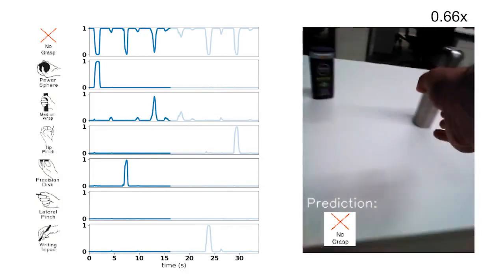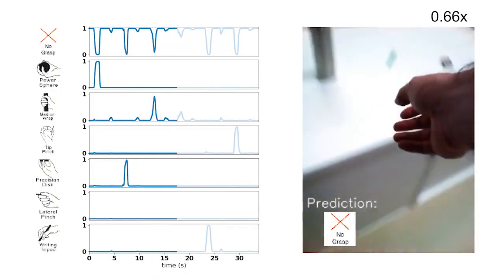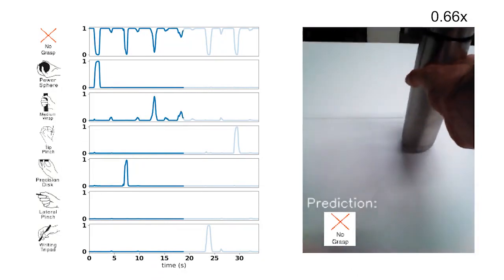Next is a coffee thermos, which will produce a probability spike in medium-wrapped, but fails to predict the grasp.